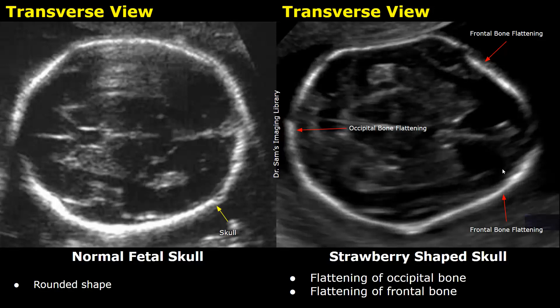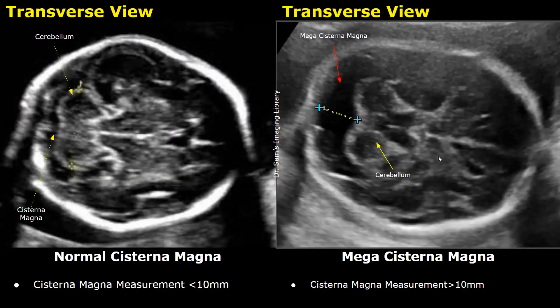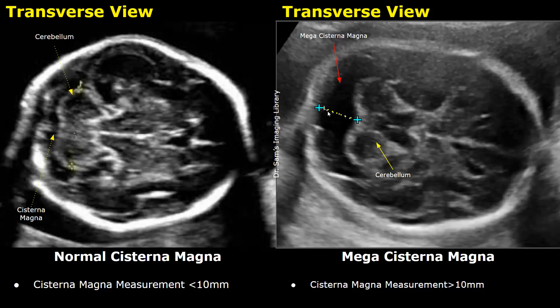The posterior fossa of the brain can also be affected by Edwards syndrome. Cisterna magna is a fluid filled space behind the cerebellum. This anechoic space behind the cerebellum is the cisterna magna. Normally it should not measure more than 10 millimeters — a measurement below 10 millimeters is normal. In mega cisterna magna, this cisterna magna measurement will be more than 10 millimeters and is considered abnormal.